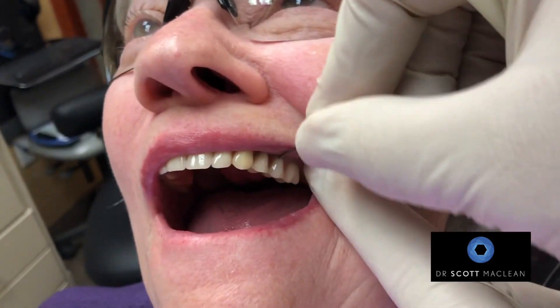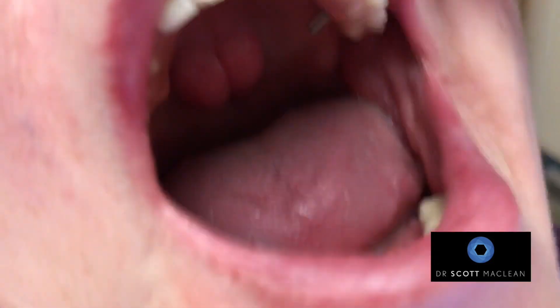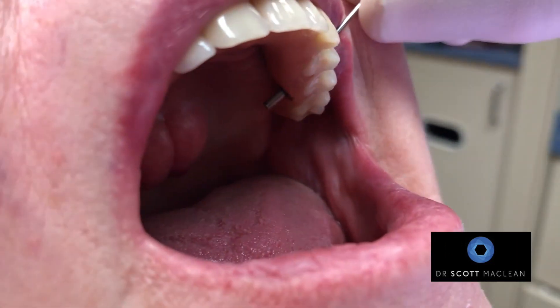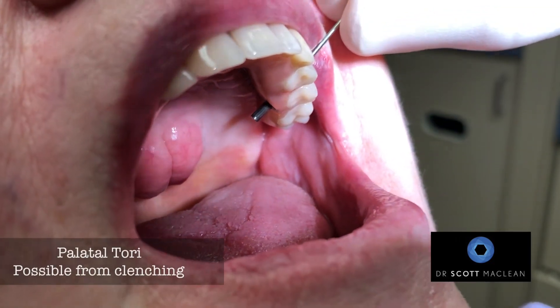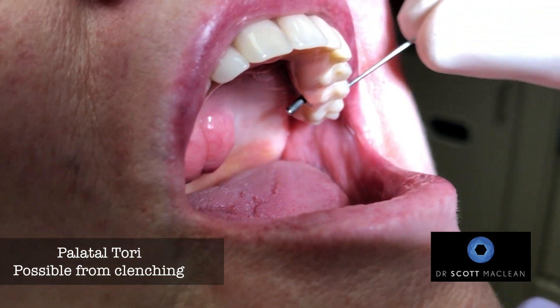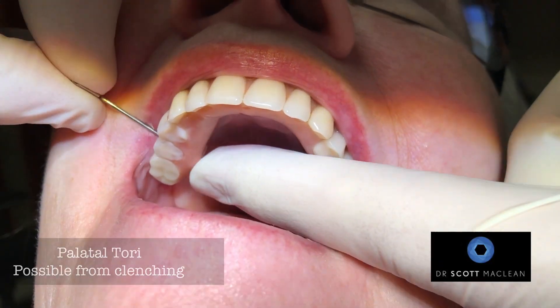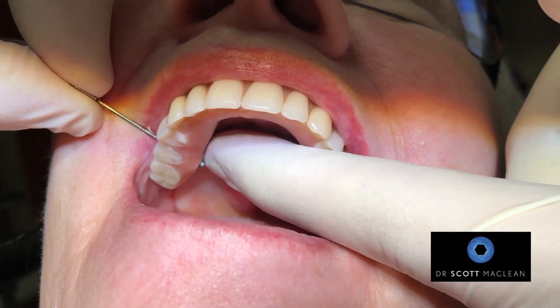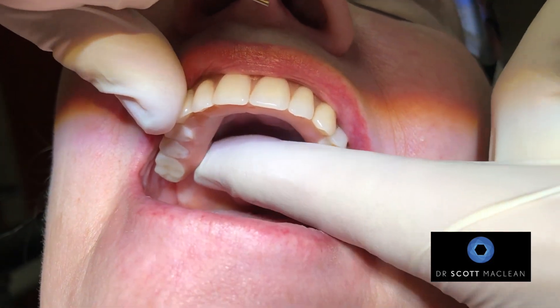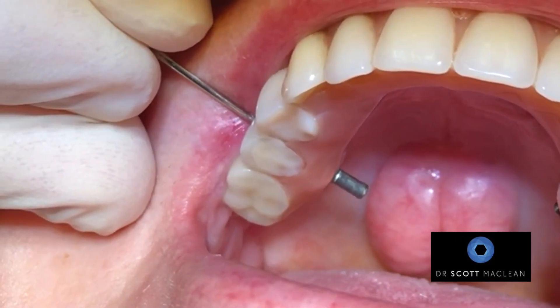We're going to demonstrate how this kind of comes in and out. If I push this little ring, you can see underneath inside there's a little arm that comes through. This little arm is what holds it in — there's a little catch that goes through. So as I push it like that, pushing this pin back and forth — this is a Marius bridge. When we go into this channel and push it, it unlocks it.